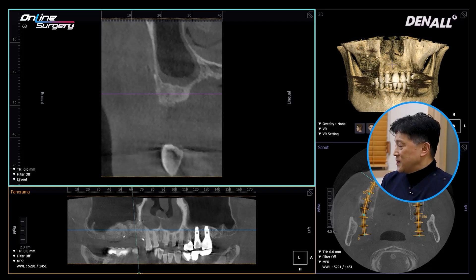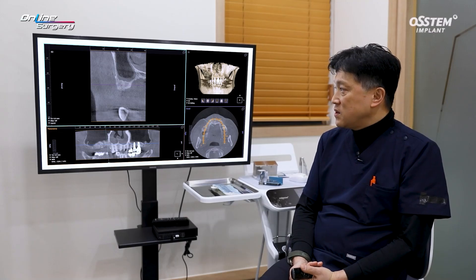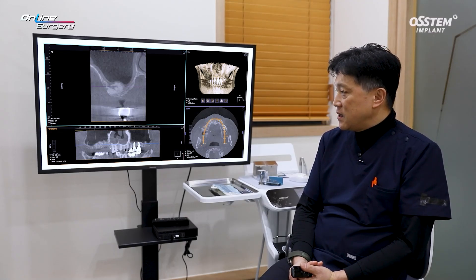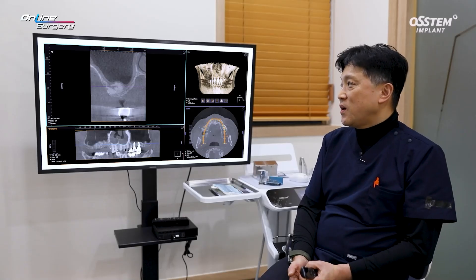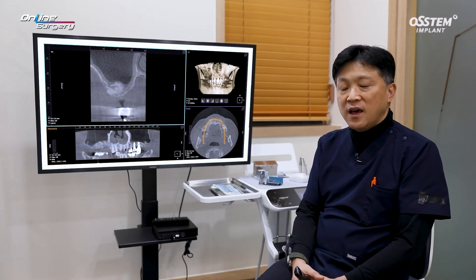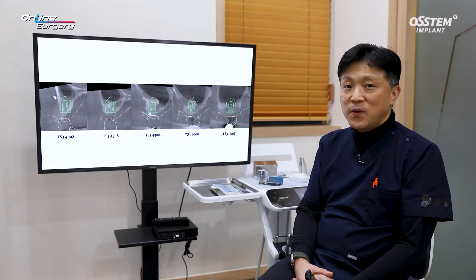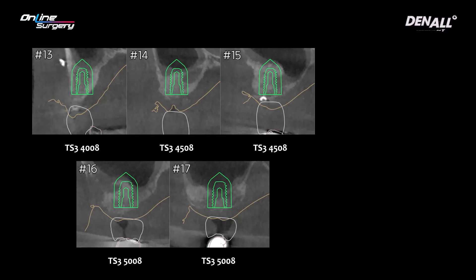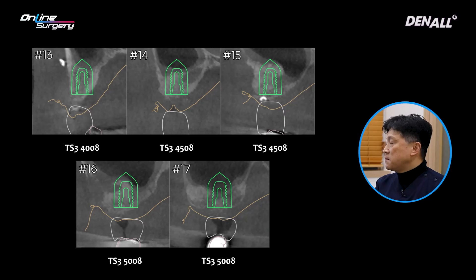Perhaps due to a lack of technique or skills, a problem occurred once again. The sinus graft material that previously showed infection was improved, but perfect bone graft regeneration was not achieved and significant resorption occurred. Because the results were not ideal and the desired amount of bone formation was not achieved, implants were placed using a surgical guide. The plan was: 4×8.5 mm in number 13; 4.5×8.5 in 14; 4.5×8.5 in 15; 5×8.5 in number 16; and 5×8.5 in 17 — five implants total.